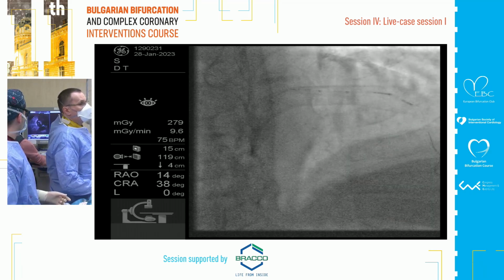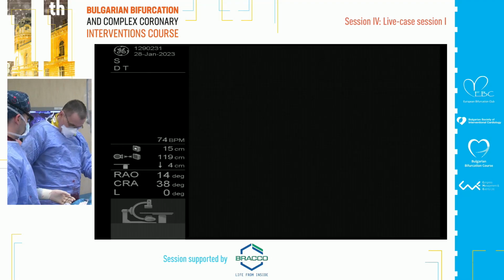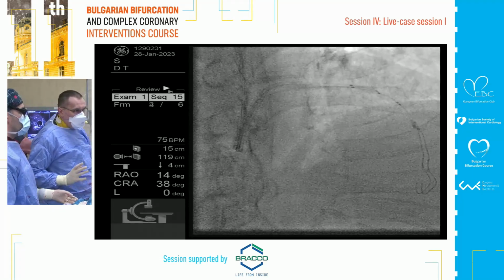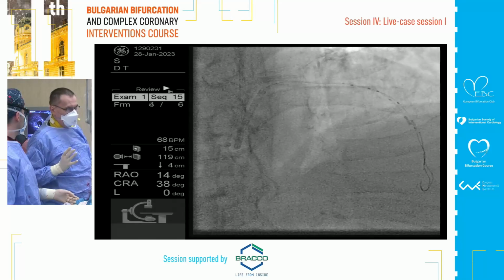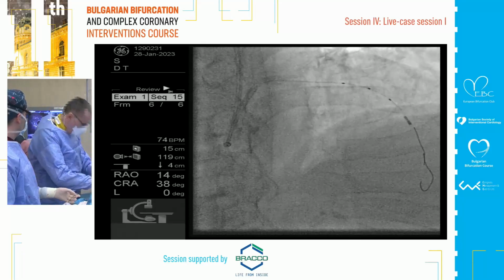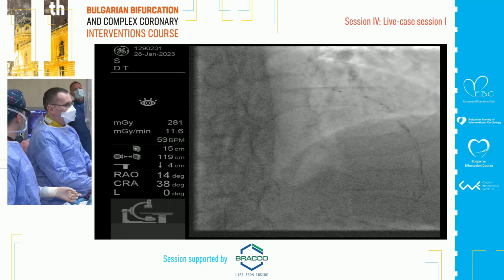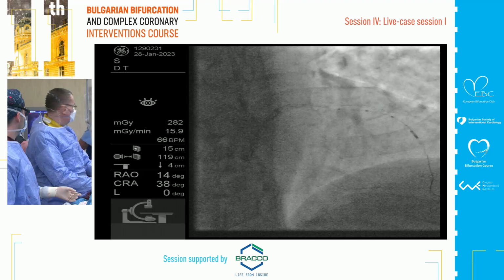Oh, I see the lesion. Okay, Dobrin, we look good now. IVUS, and after that we move to the post-cath lab. Ravi, start pullback. I think that's enough for the strategy. Okay, pull back slowly. But what if it didn't go? Then this is just plaque modification without plaque debulking.